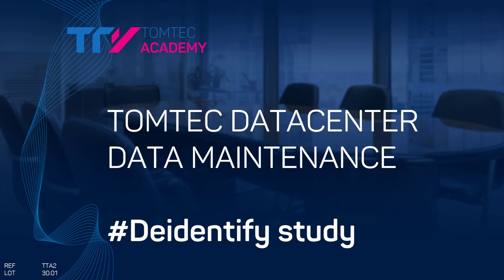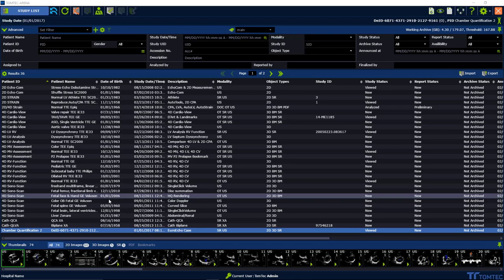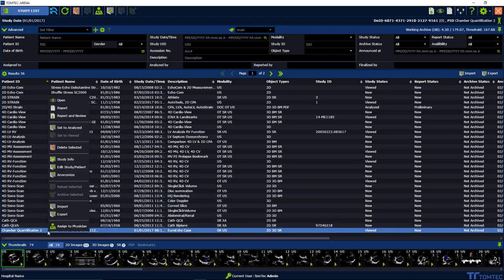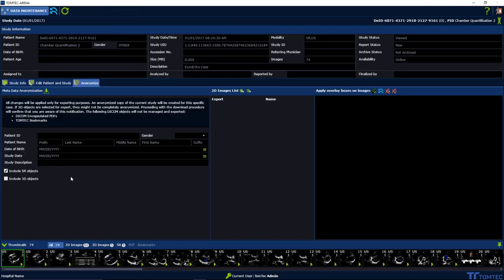How to de-identify a study in TomTech Data Center. Select a study in the list, press right mouse button to launch the submenu, and choose Anonymize.